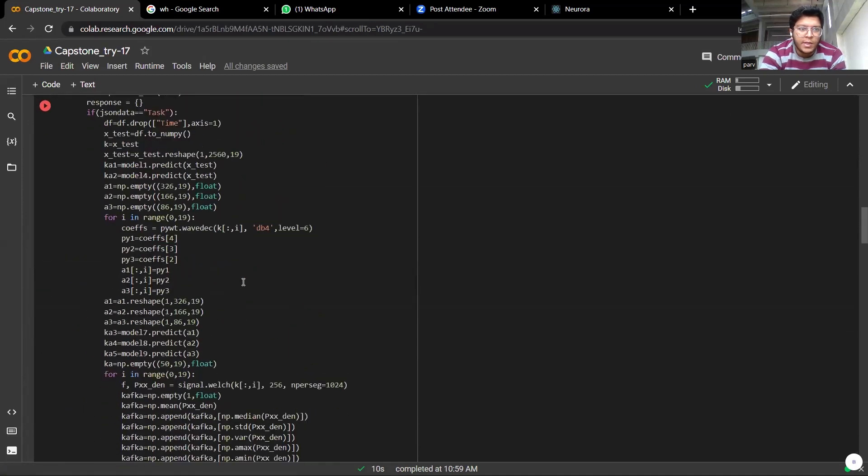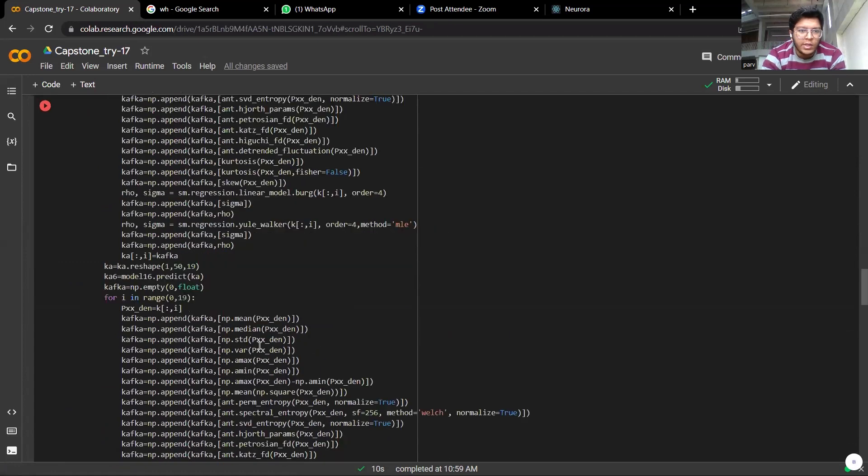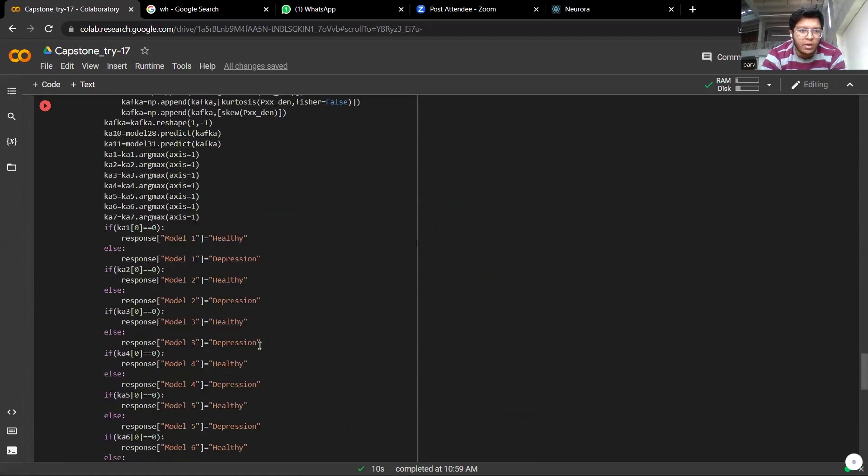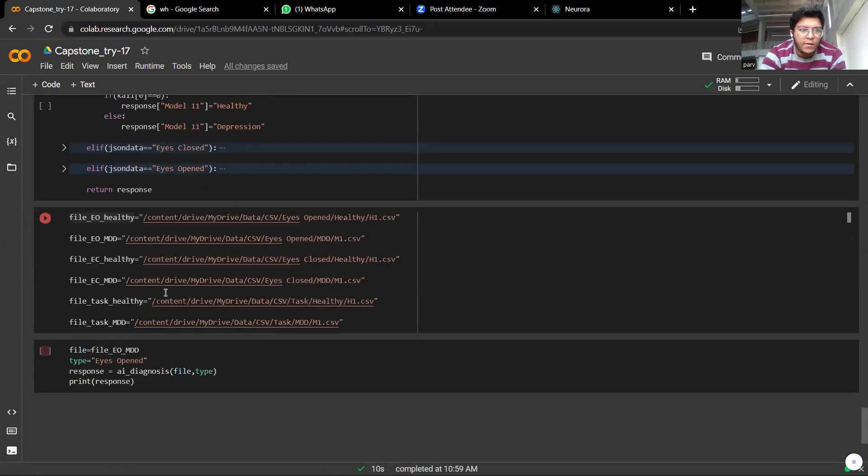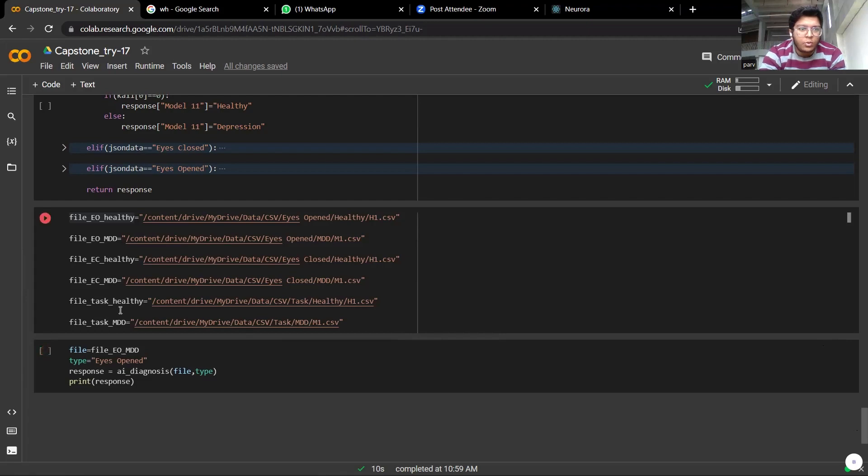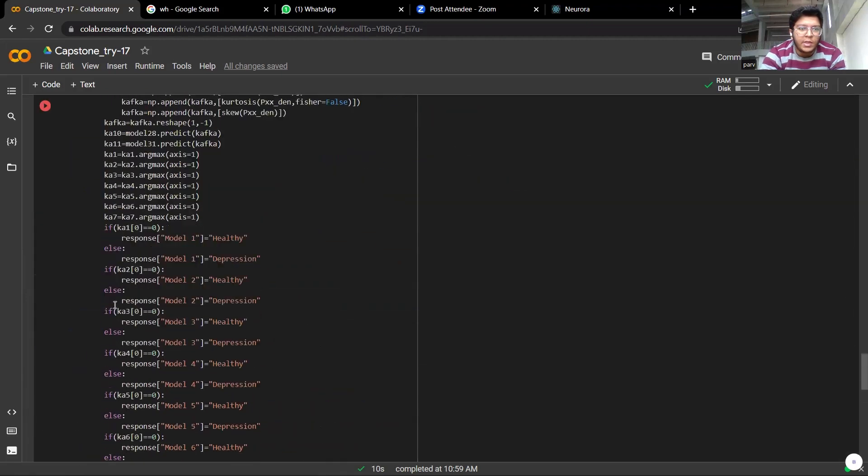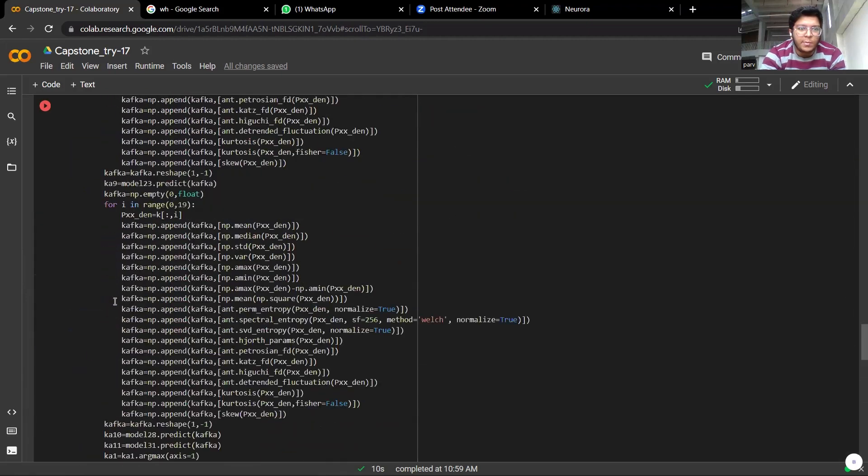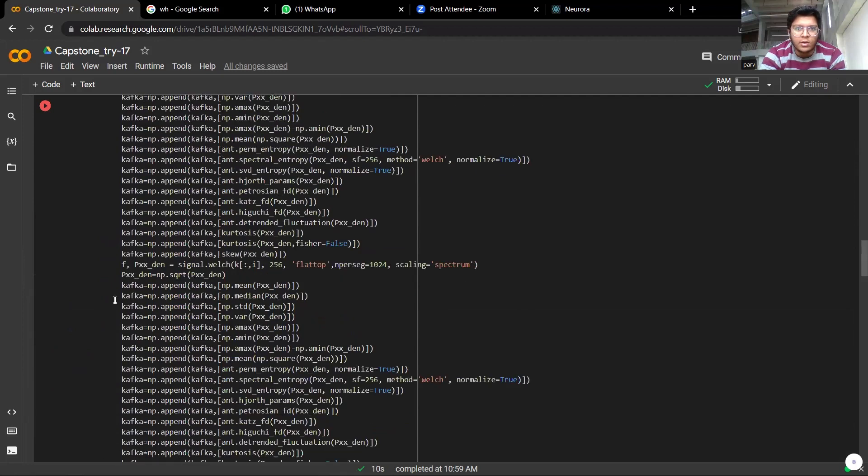So basically we have used three types of data of the users. First is the eyes open, then there is eyes closed, then there is performing a task. So here you can run all these files to know whether the patient is diagnosed with depression or he or she is healthy.